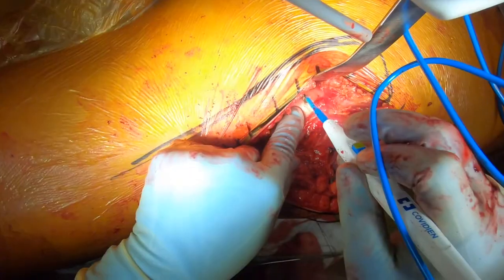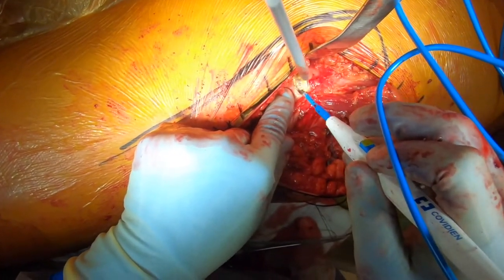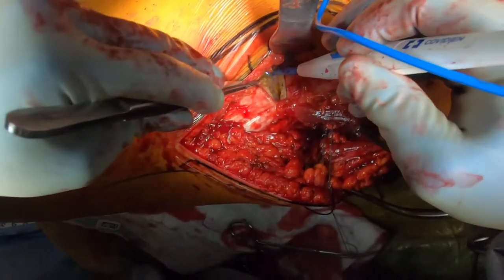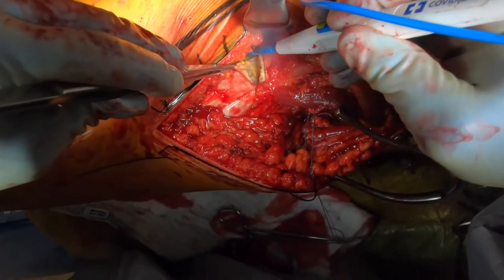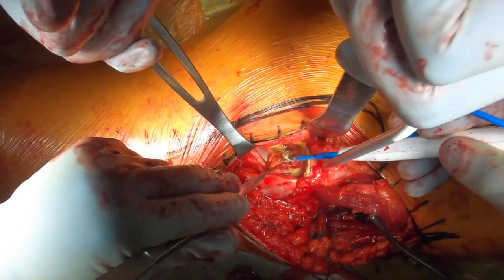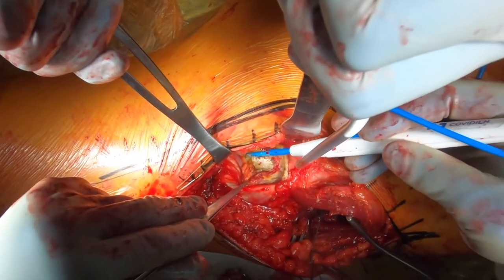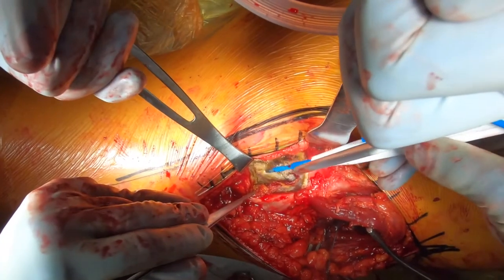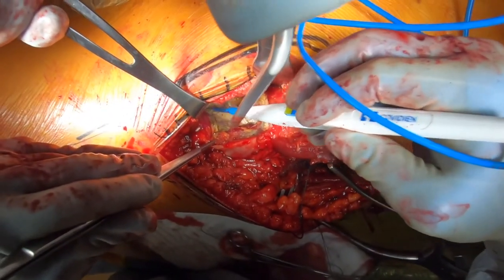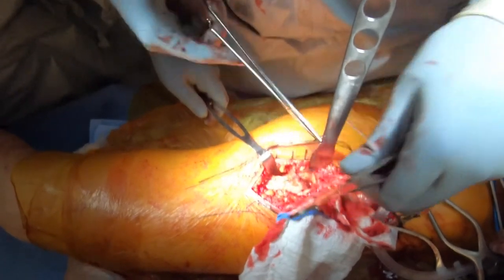The vastus lateralis is then elevated with a partial transverse limb across the vastus ridge, followed by a sub-vastus elevation posteriorly. This is to facilitate exposure for placement of the sliding hip screw device. Bovie cautery is then used to elevate the vastus lateralis off the proximal femur, and the corner is then tagged with a number two Ethibond.